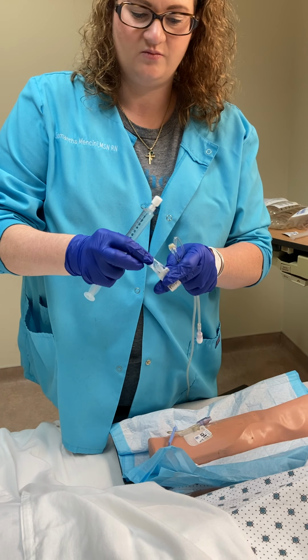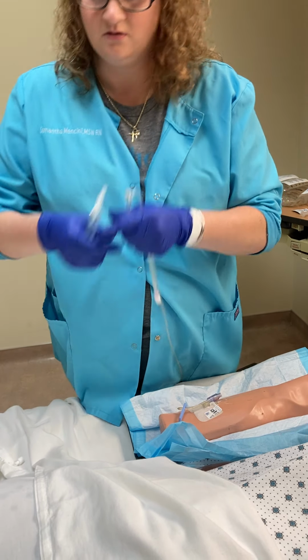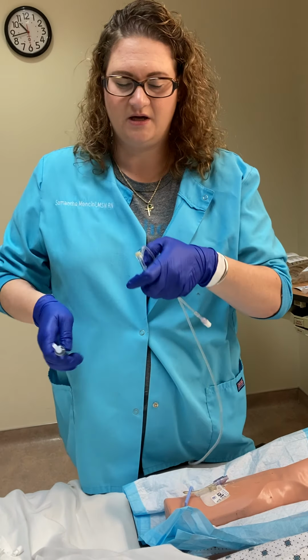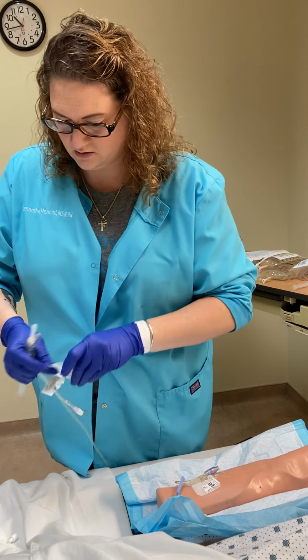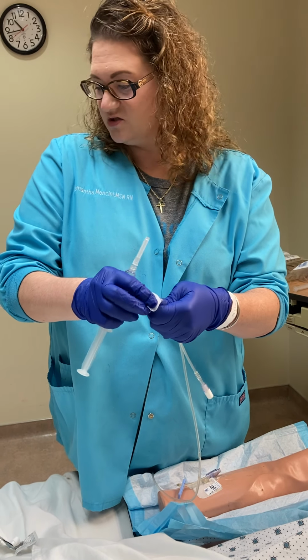Now, remember, we're going to peel it like a banana. Get your bubble all the way out. Again, cleaning for 15 seconds and then allowing it to dry.